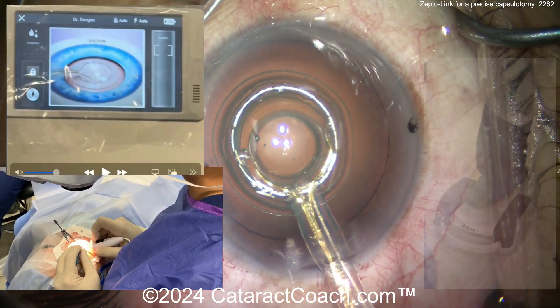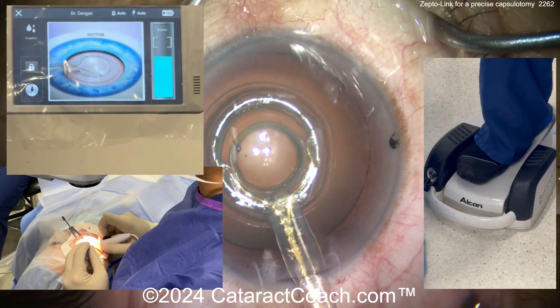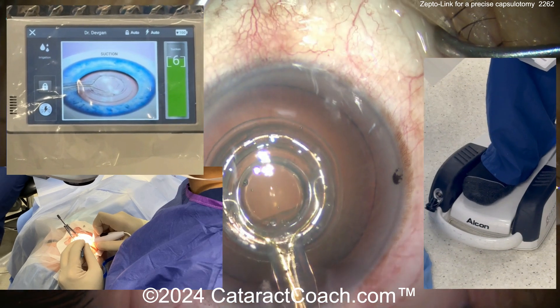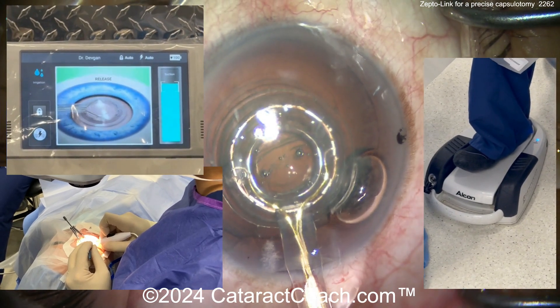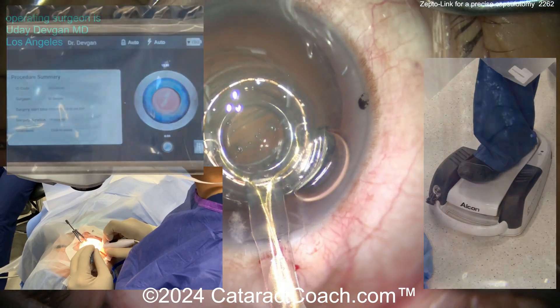On my phaco foot pedal, let's hit the pedal — vacuum on. The pedal goes down. On the top left corner of the screen you see the machine count down: 10, 9, 8, 7 seconds. The newer versions will count down even fewer seconds if you'd like, but here's a 10-second countdown.